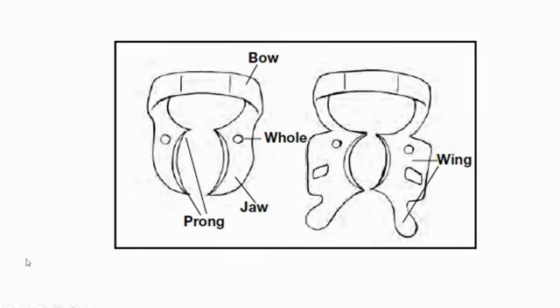यू विल सी नाउ. सो वेरी सिंपल, यू कैन सी अ रबर डैम clamp.